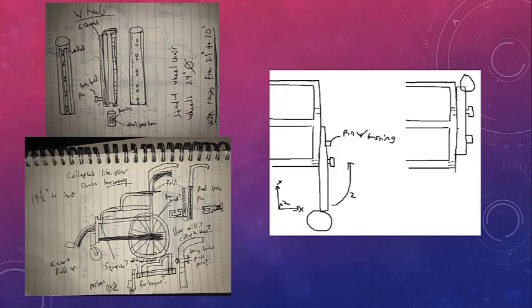I then realized that the wheels being adjusted would mean nothing if the caster wheels stayed the way they were. So I determined I could have them swing up and down with a locking pin and bushing as seen in the rudimentary drawing here.